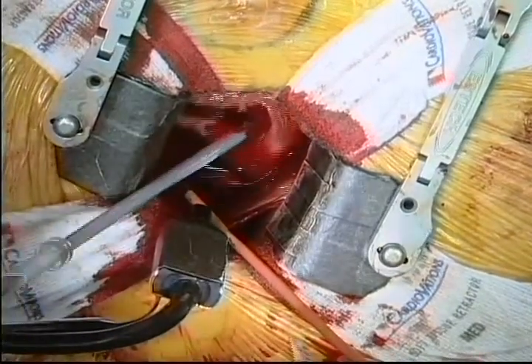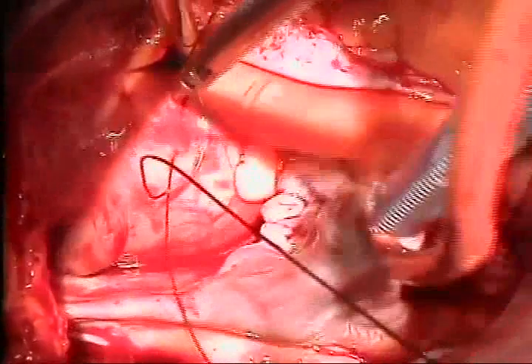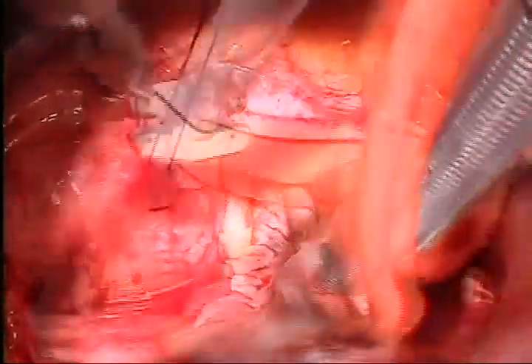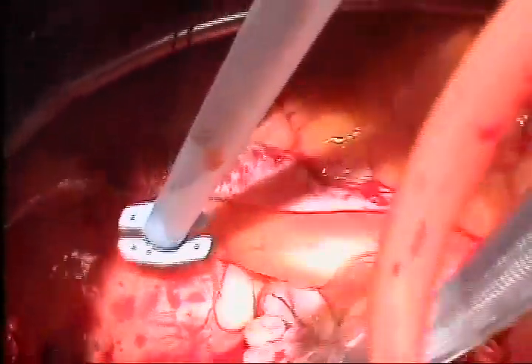Then, with the patient on full cardiopulmonary bypass, attention is turned to the antegrade cannula. The aorta is visualized, and the antegrade catheter is placed low beneath the fat stripe on the aorta. A purse string suture is positioned, and then a specially designed long, flexible antegrade catheter is placed. This is quite low to give room for aortic cross-clamping.